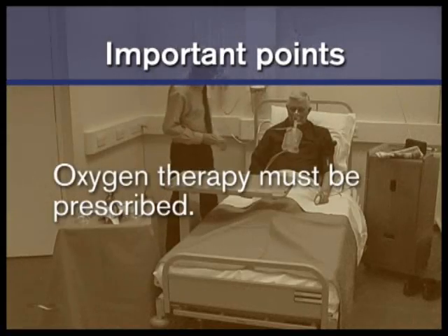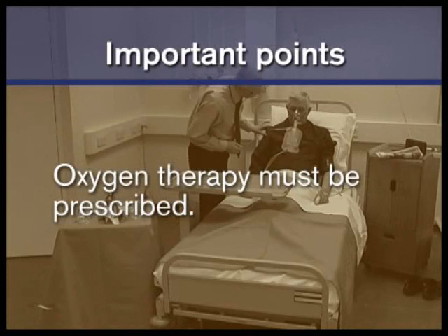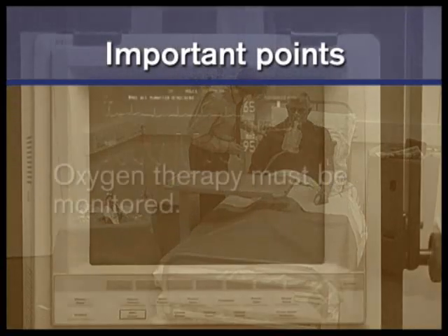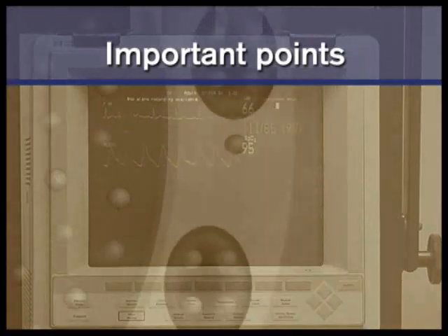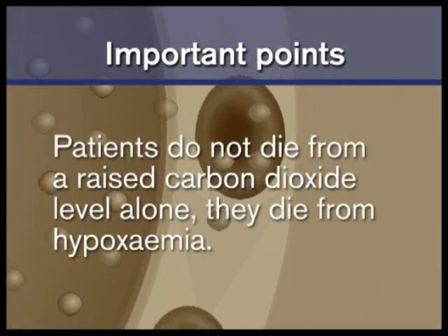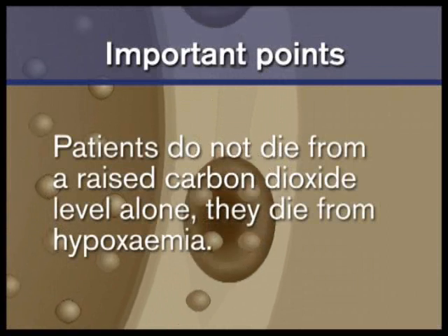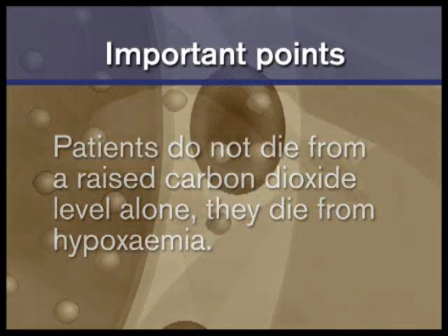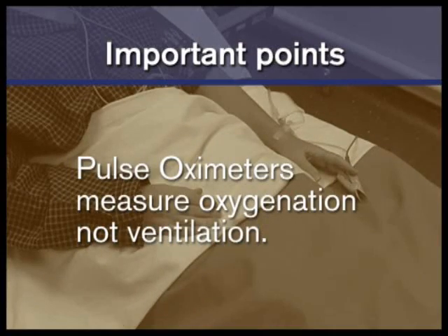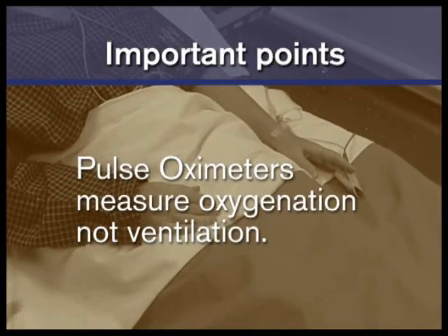Oxygen therapy must be prescribed. Oxygen therapy must be monitored. Patients do not die from a raised carbon dioxide level alone. They die from hypoxemia. Pulse oximeters measure oxygenation, not ventilation.